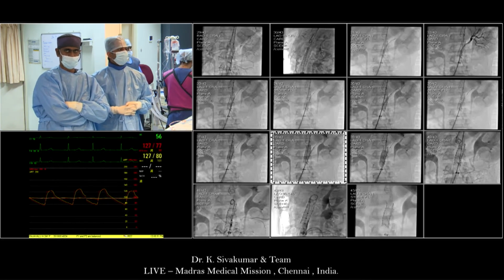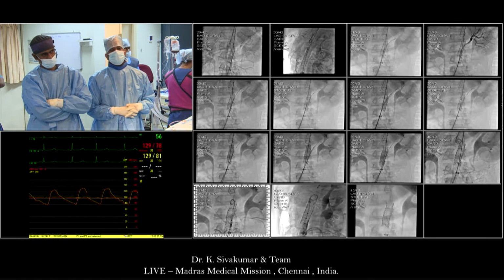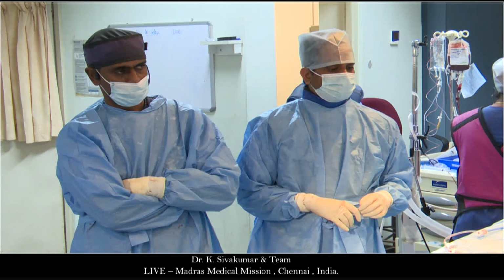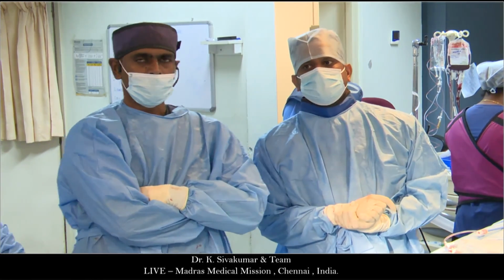Okay, that's fantastic. These are very rare cases. I think you demonstrated very well how to rehabilitate this. Congratulations again to you and to your team. We really appreciate it, and a big hand of applause.